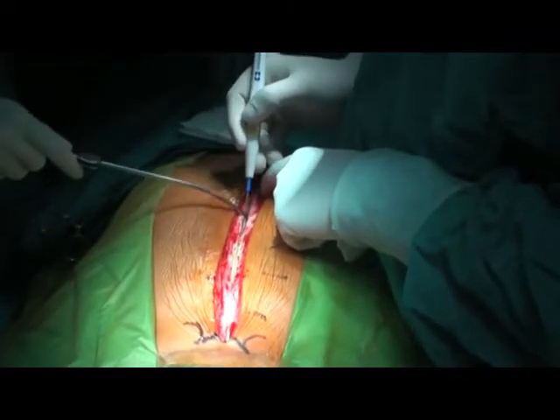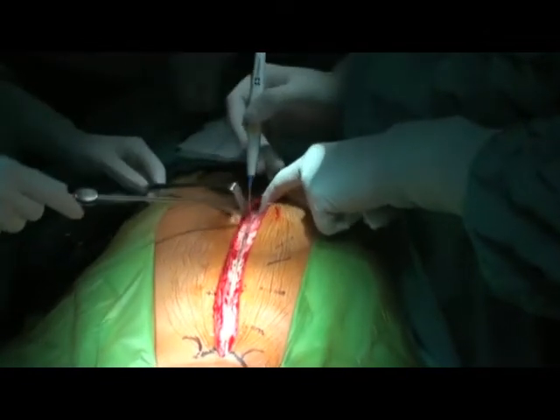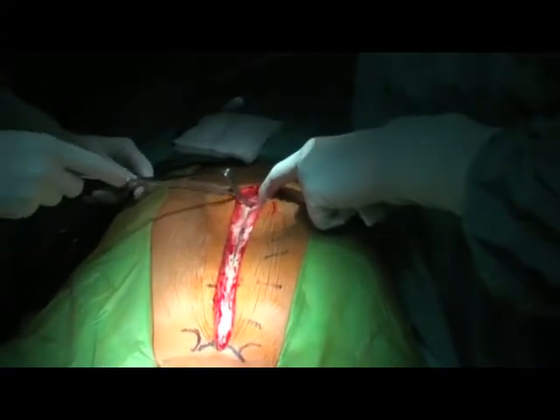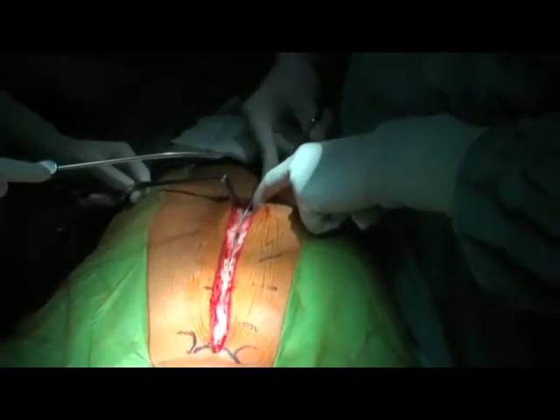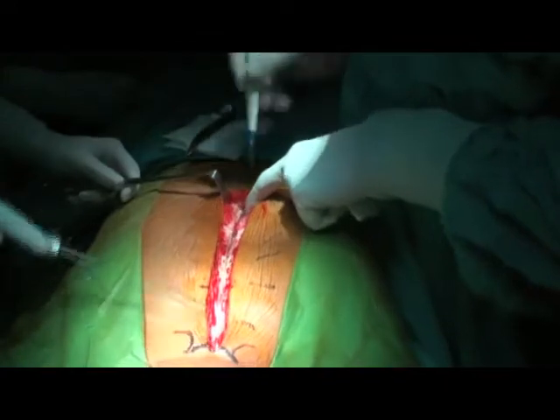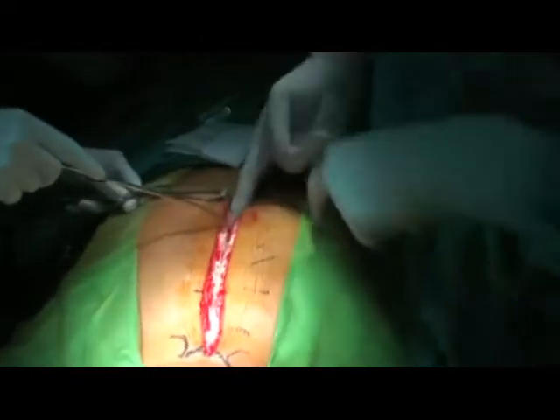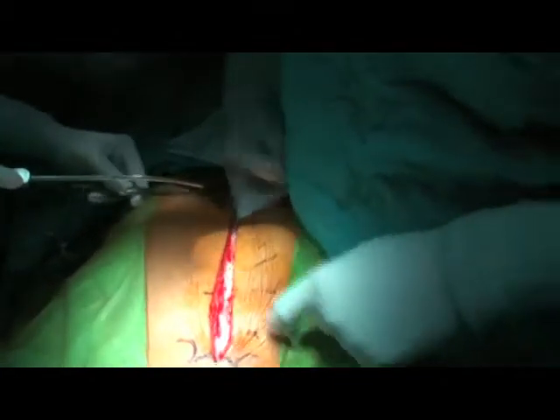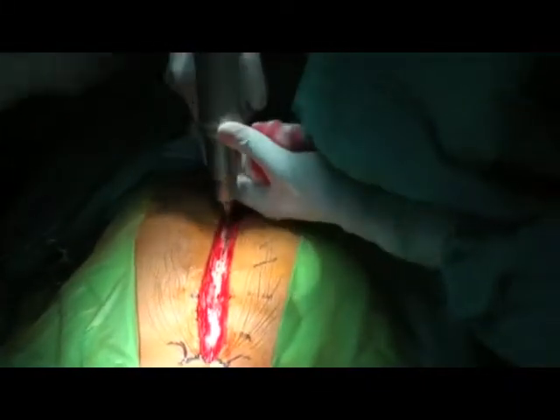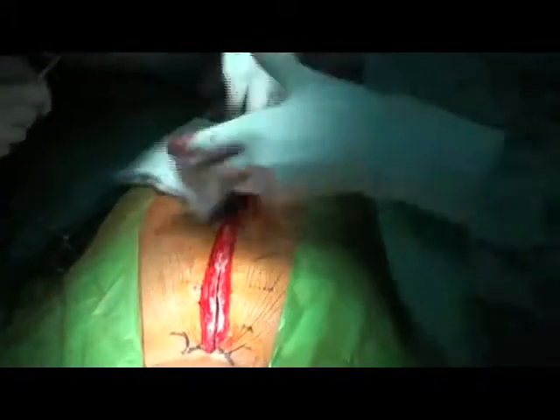Below the xiphoid, the fascia is cut in the middle and using a scissor you cut the xiphoid process. After cutting the xiphoid process, take care as sometimes there is a vein which can bleed profusely. You then put your finger behind the xiphoid process, anterior to the diaphragm, and make a little space before you start sawing the sternum with the sternal saw. Keep the sternal saw with a little traction upward so that the underlying pleura and pericardium are not damaged.